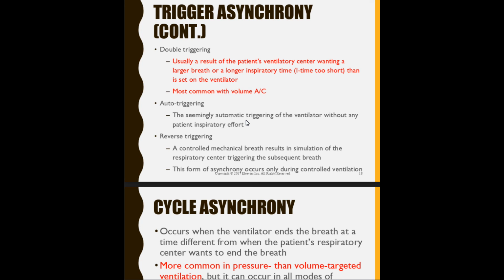Auto-triggering is when it just triggers. Okay? It just happens. It gives a breath regardless of whether the patient triggered the breath or it was triggered by time. So it just delivered a breath. That might be where you have issues with your ventilator when you have some auto triggering.